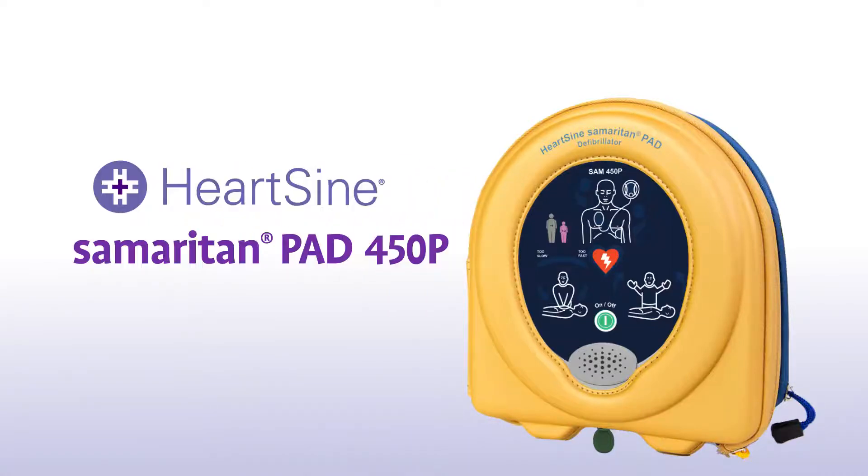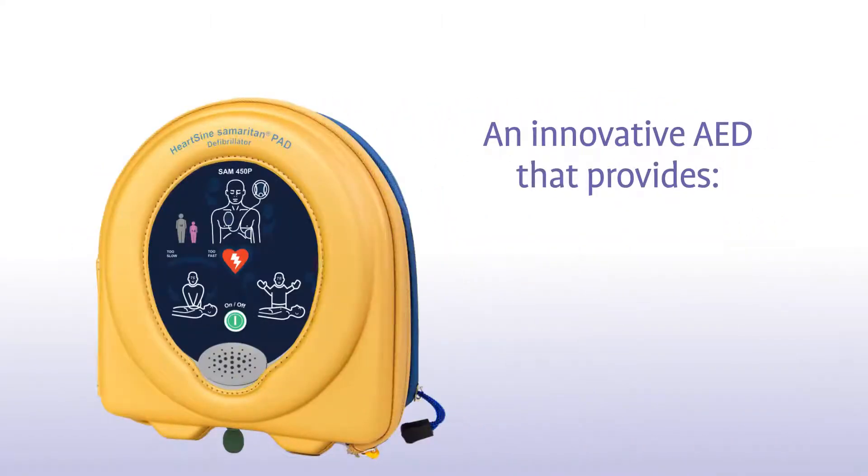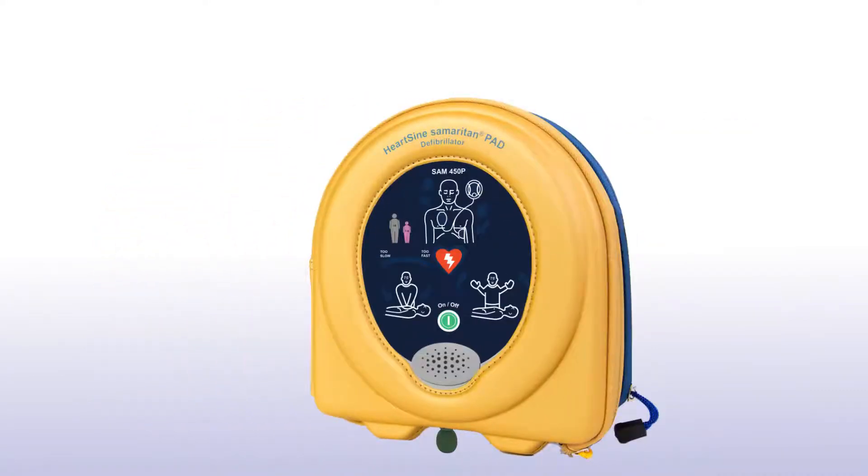You have purchased a HeartSign Samaritan PAD 450P featuring CPR Rate Advisor, an innovative AED that provides real-time feedback on the rate of CPR. Let's look at how to use one in a life-saving situation.